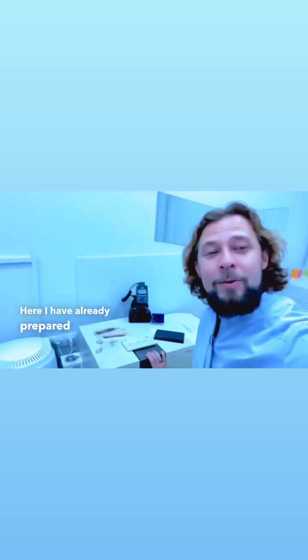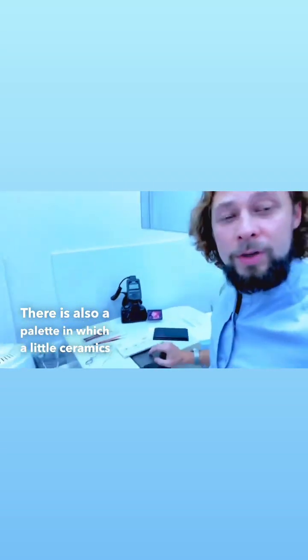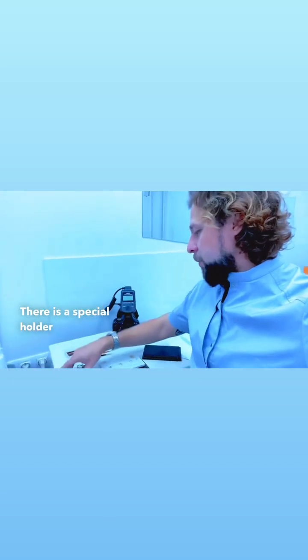Here I have already prepared a table for myself. As usual, I have a photo of the tooth that I will need to recreate on my table. Today we are working with this fourth tooth and we will try to draw it. There is also a palette in which a little ceramics are diluted, a little paint, glaze, which we will apply later. There is a special holder to hold the crown.